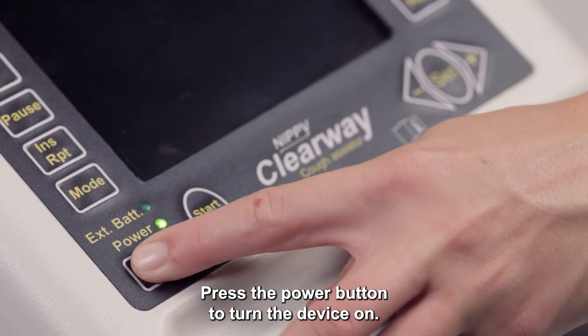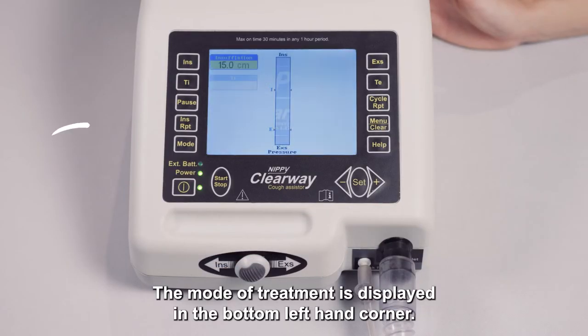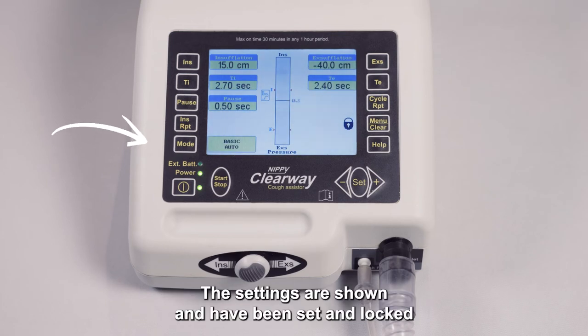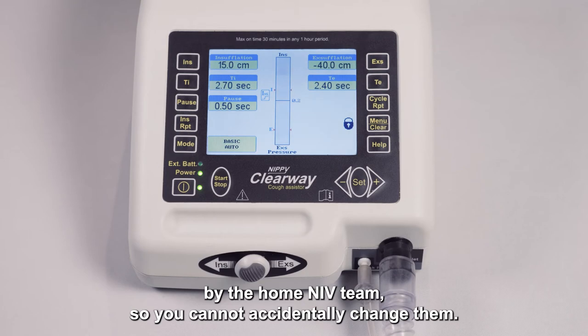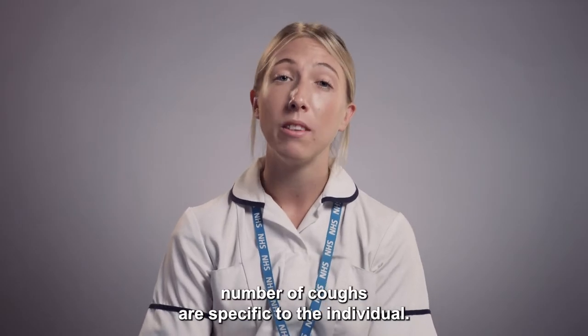Press the power button to turn the device on. The mode of treatment is displayed in the bottom left-hand corner. The settings are shown and have been set and locked by the home NIV team so you cannot accidentally change them. The settings and number of coughs are specific to the individual.